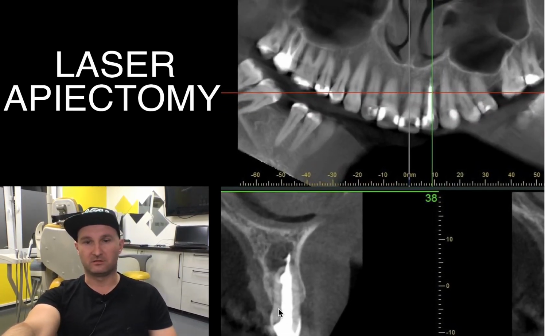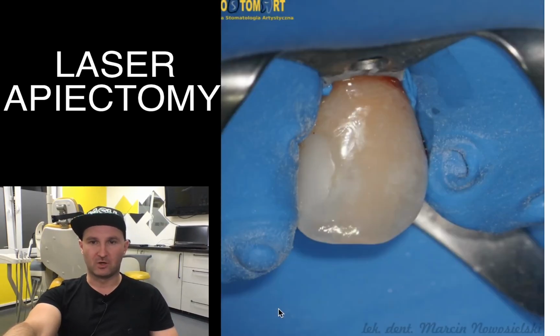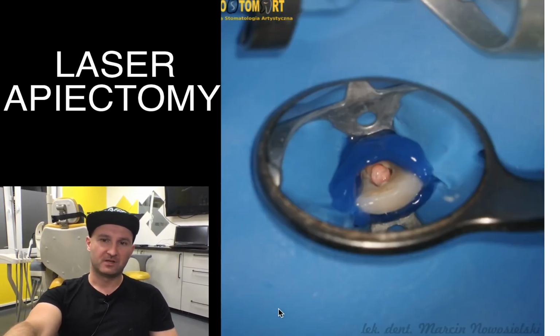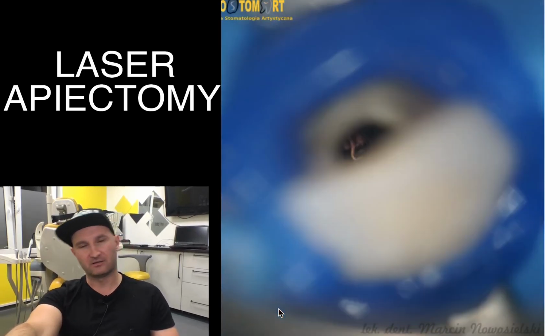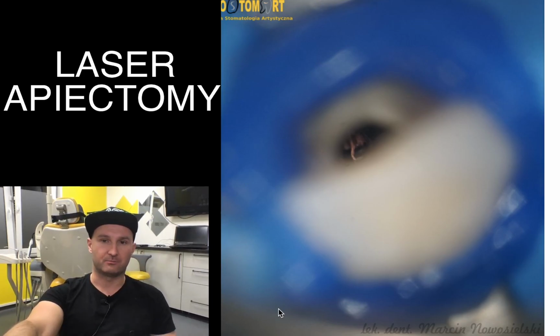So we did not want to weaken the teeth additionally. So our preparation was really gentle in this case. We just took our time, a lot of time for irrigation. It was much more important to do the chemical preparation than mechanical preparation.